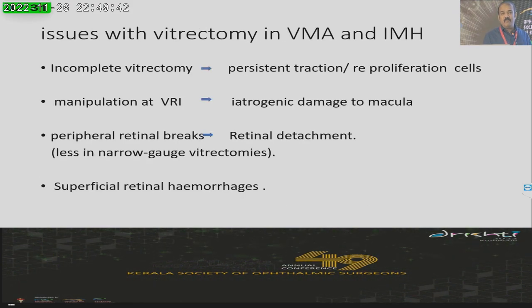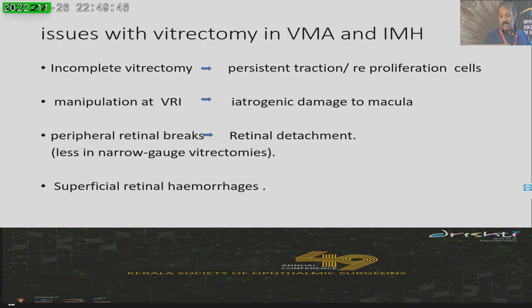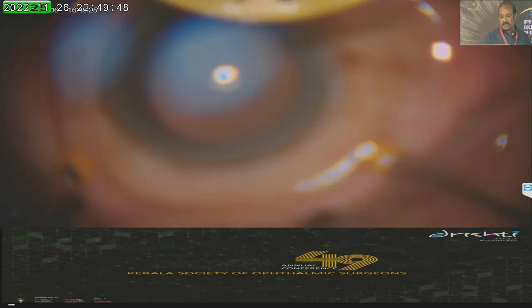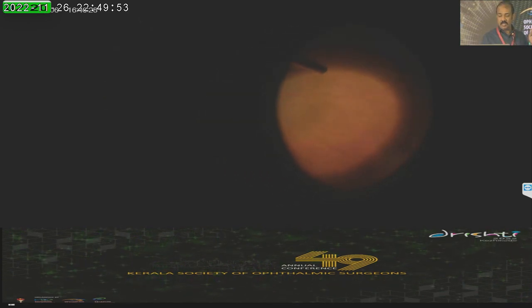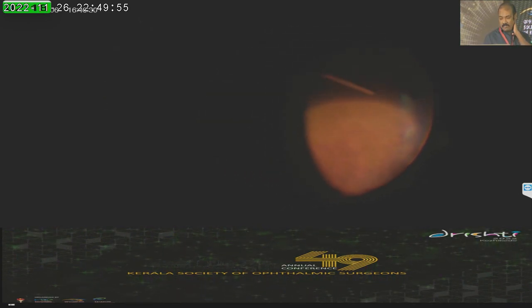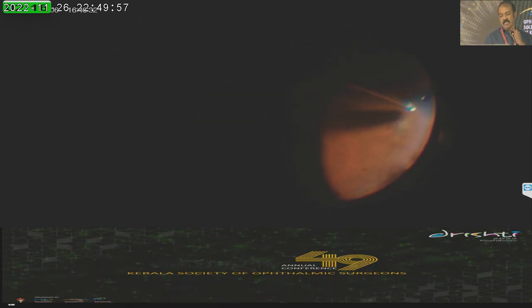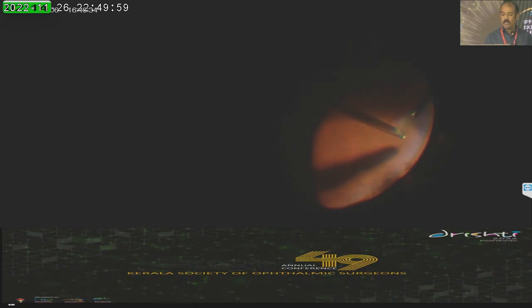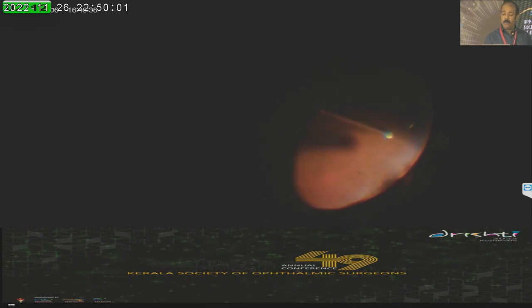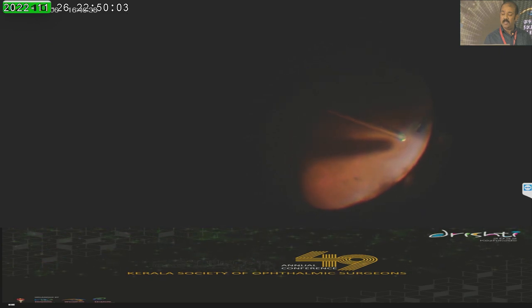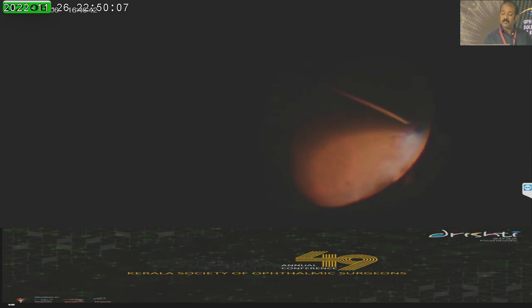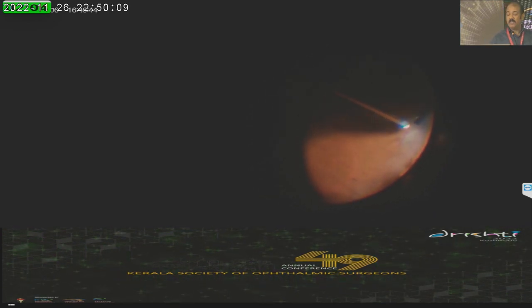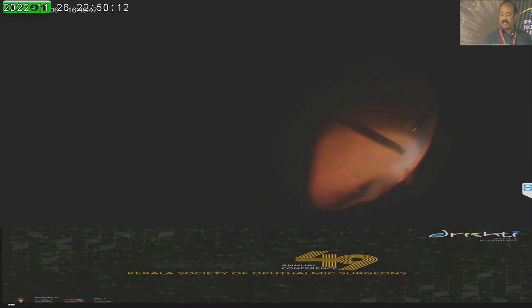In one case, after finishing a nice vitrectomy and leaving the macula quite healthy, on examination of the periphery, I could see a little lattice which had become more evident — possibly because of the PVD or traction during vitrectomy. So I decided to do vitreous shaving at that area, at the base, keeping the area around the lattice traction-free. But while doing vitrectomy near the lattice, there was a de-roofing of the retina on that lattice and it became a hole — so I had to treat it with laser or cryo, otherwise it would have resulted in retinal detachment.